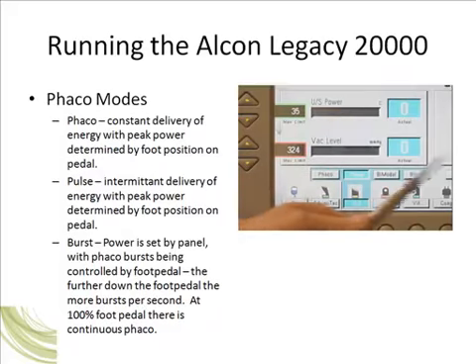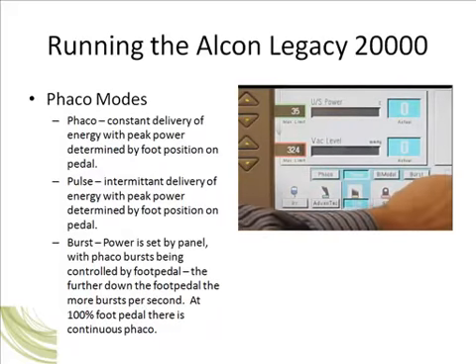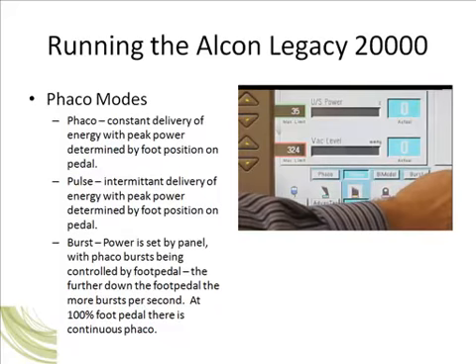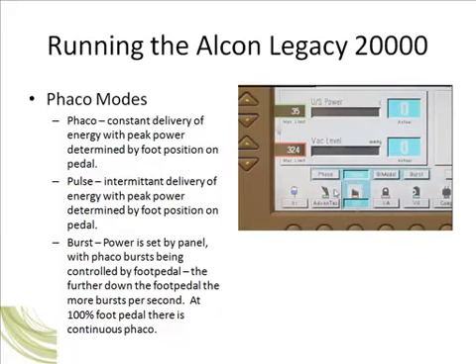There are different phaco modes that have been designed to optimize the delivery of the phaco energy, making it more efficient. These different modes on the legacy machine can be seen above the ultrasound icon by the cursor here. The different modes are phaco, pulse, bimodal, and burst. These energy modes deliver the energy differently. However, they all provide you with phaco energy when you enter foot position 3.